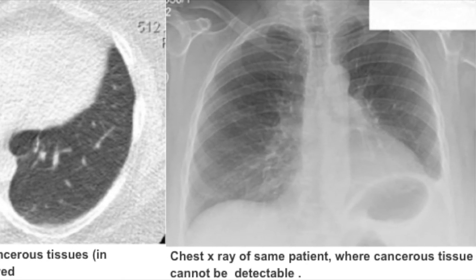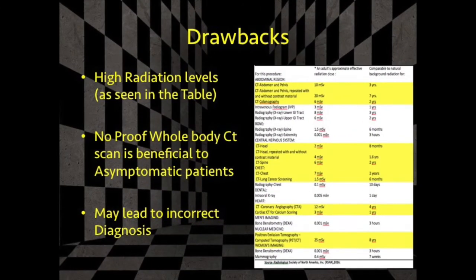The main drawback of whole-body CT scan concerns that it generates a higher dose of radiation than other imaging modalities. The whole-body CT scan exposes a relatively high amount of ionizing radiation, as estimated around 12 to 20 mSv, which is 4 times higher than the average annual dose of radiation obtained from natural sources such as soils and rocks, which would increase the potential risk of developing a cancer.